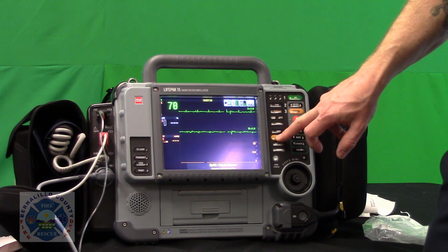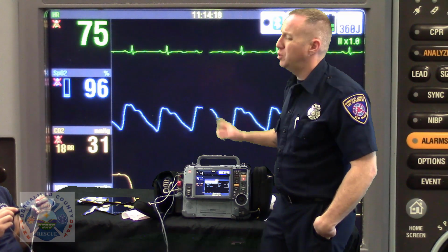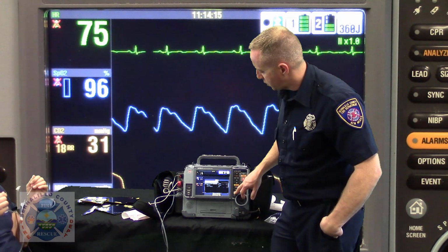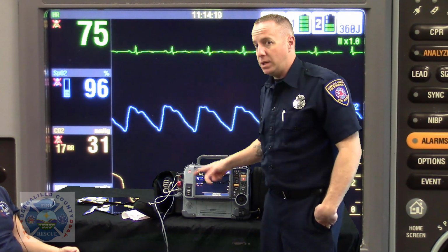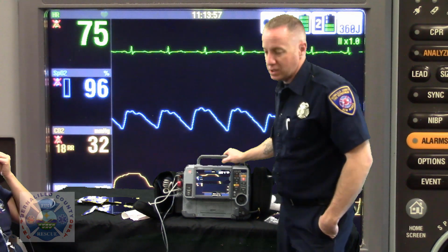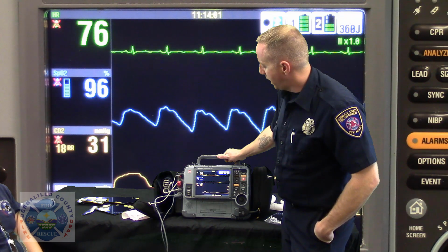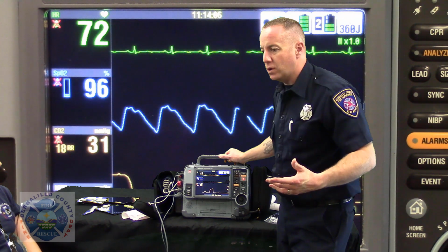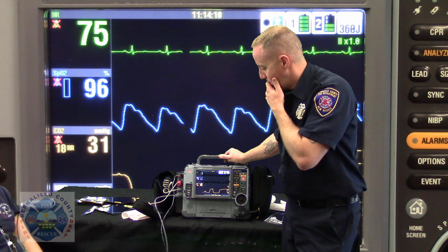So it's okay to hit alarm and silence that alarm, but you're really just silencing the alarm. You need to figure out what's wrong with your patient clinically, and you can silence it for a short time, and then it'll alarm again in another 30 seconds saying, you silenced me, but you haven't fixed the problem, we're still not breathing. It's not just going to let you silence and forget it. So again, another wonderful clinical monitoring tool, another way to gauge if your treatments are going in the direction you want them to.